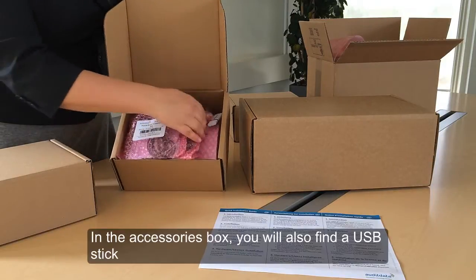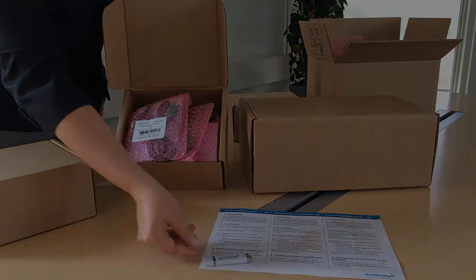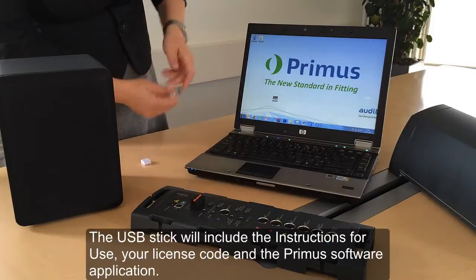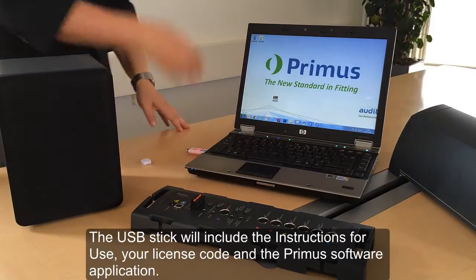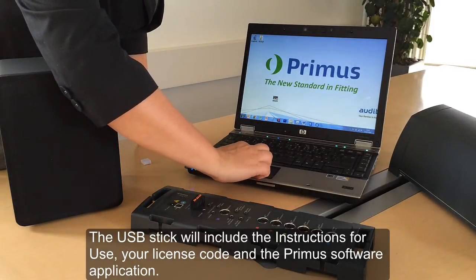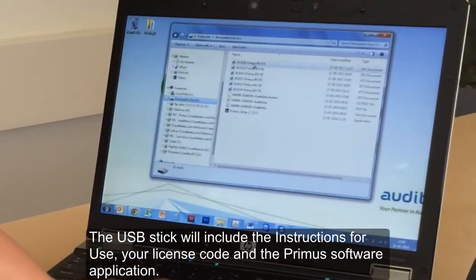In the package you'll also find a USB stick which will contain the Primus software and all of your licenses. When you plug the USB stick into your computer, you'll find that it contains the instructions for use, your license code, and Primus software. Please ensure that you read the instructions for use manual as it contains useful information on how to set up the Primus software.